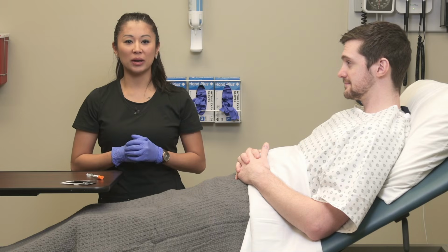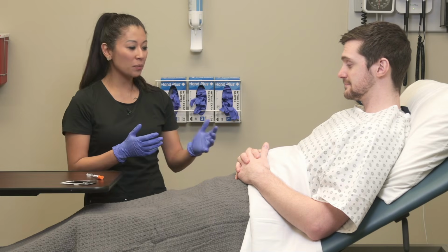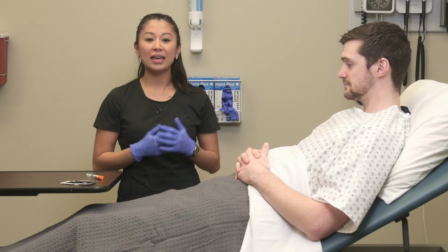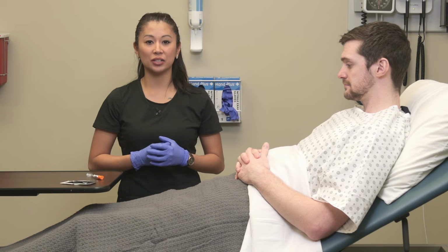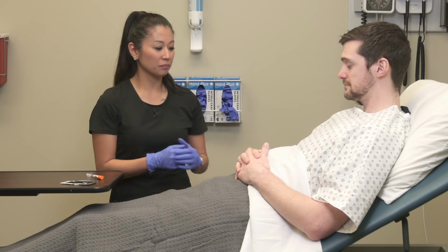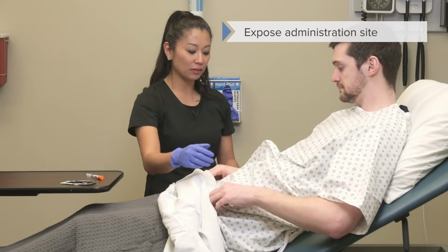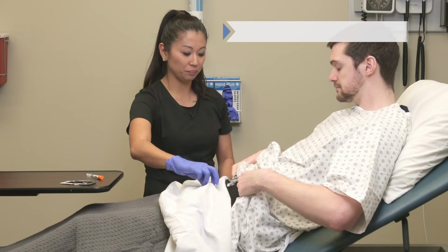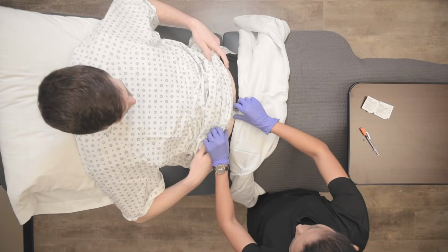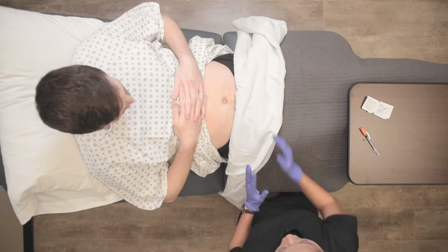Now that we've drawn up our medication, let's take a look at the actual injection itself. We want to make sure our patient's nice and comfortable, then we're going to choose our injection site. Now for this demonstration, I'm going to use the abdomen. Alright, so then I'm going to expose the site, but also try to leave the patient as covered as possible. So I only need to expose a little bit of the patient's abdomen to give this injection.